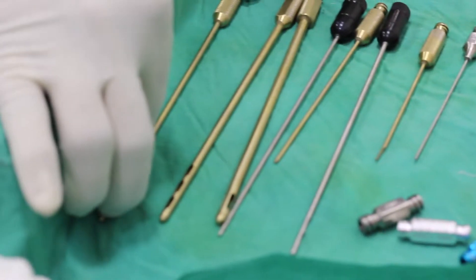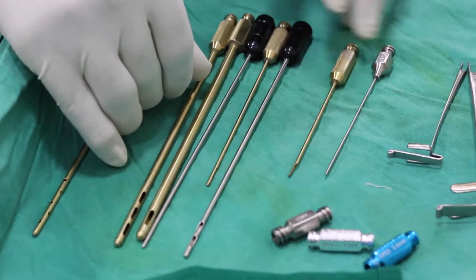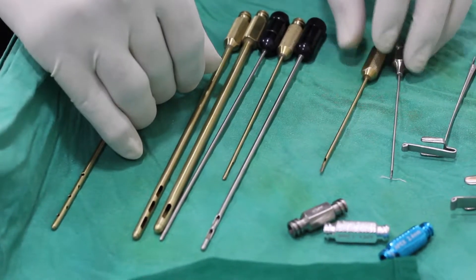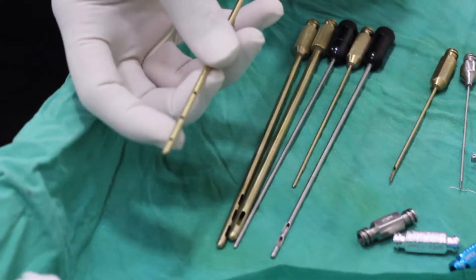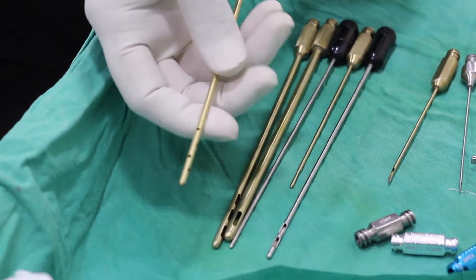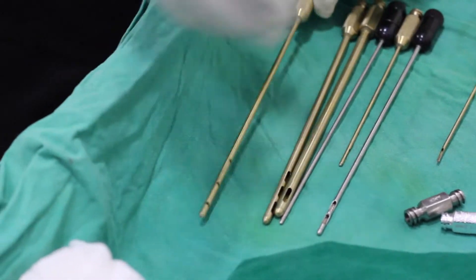Now we will quickly go through all the instruments that we usually use for a transfer procedure. There are usually three types of cannula: one is the infiltration cannula, the second one is the harvesting or suction cannulas, and the third type are the injection cannulas. The injection cannulas are the thinnest, and the infiltration cannula usually has multiple holes at its tip through which the fluid is injected into the area from which we are going to harvest the fat, and that is usually tumescent fluid.